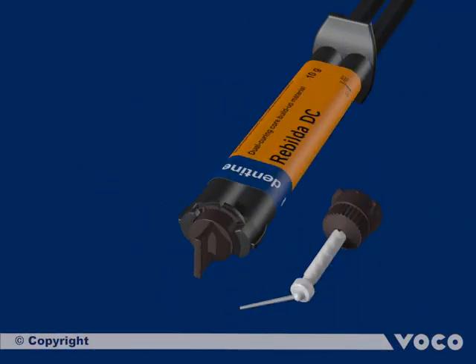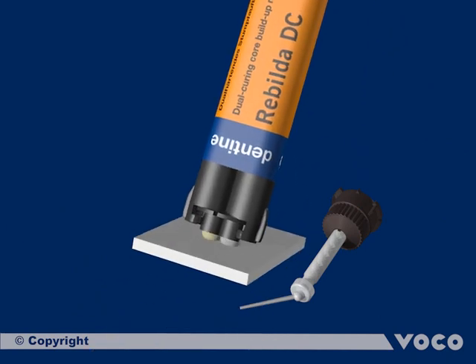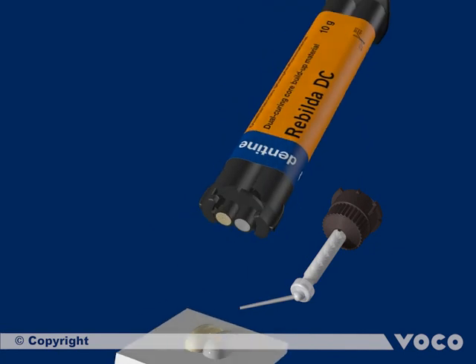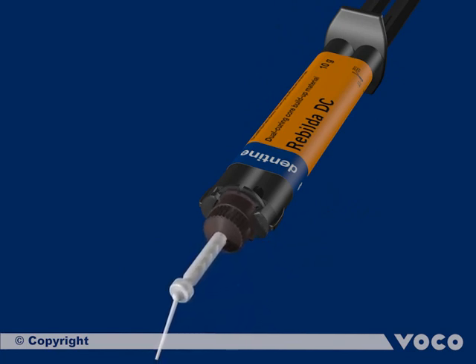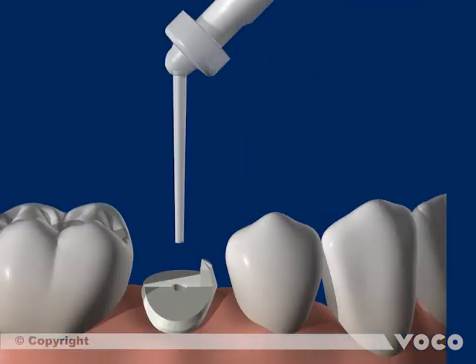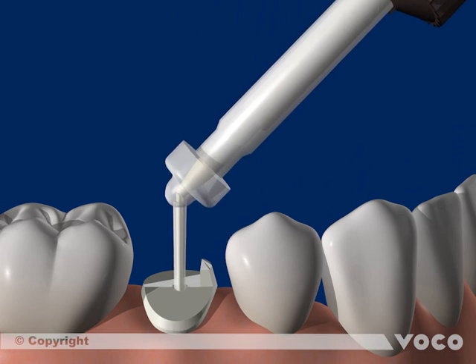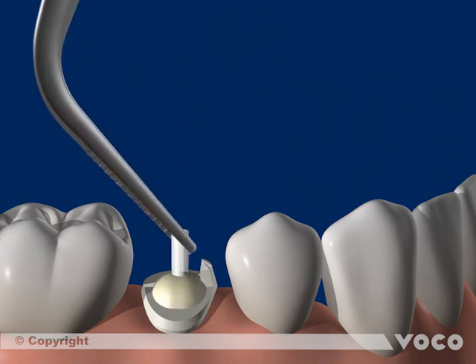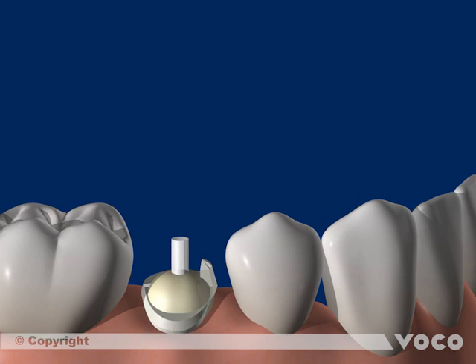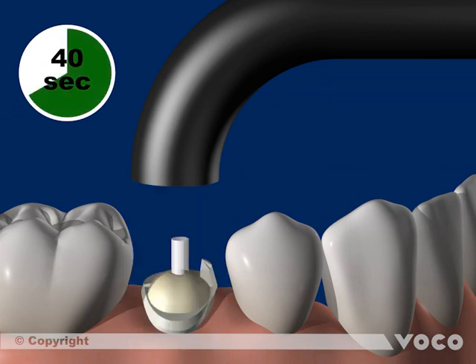After the bonding step, a luting composite is applied into the root canal. If a quick mix syringe is used for the first time, a bleeding step is mandatory to even up the filling levels of both chambers and ensure a 1-to-1 mixing ratio. Rebilda DC is supplied with an endodontic cannula that fits perfectly into the root canal. To prevent air bubbles, the tip of the mixing cannula must be inserted deeply and always remain inside the material. Then the silane-coated root post is inserted into the root canal, and the composite surplus is light cured initially to fix the root post coronally.